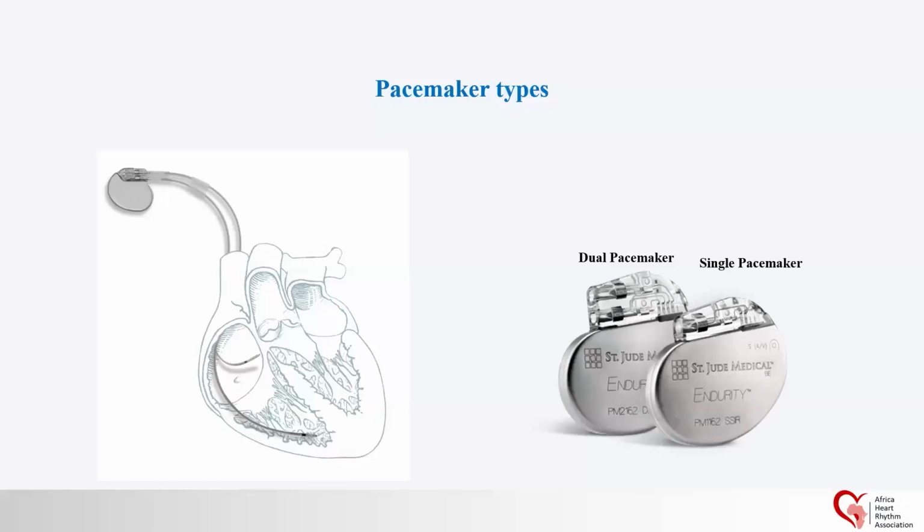We will cover these three parameters in this presentation, because these parameters determine the longevity of the battery depending on their values.